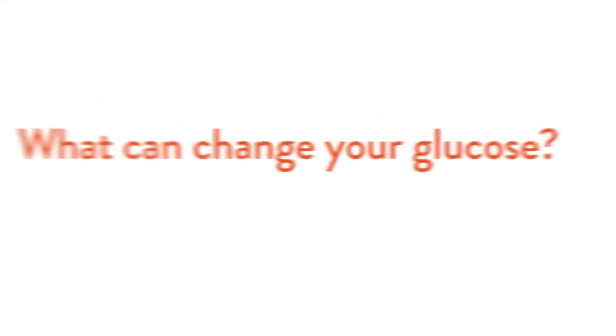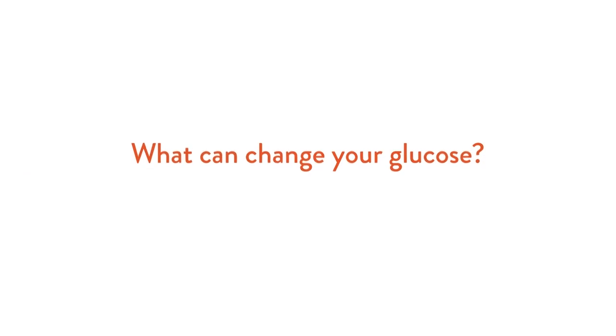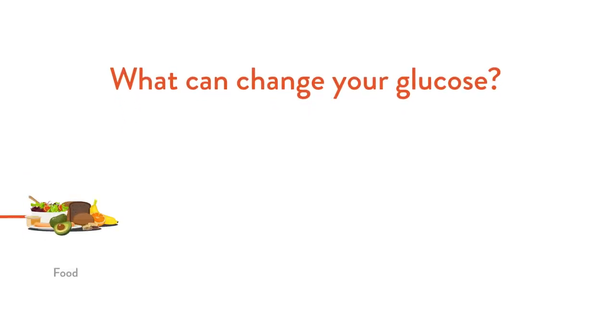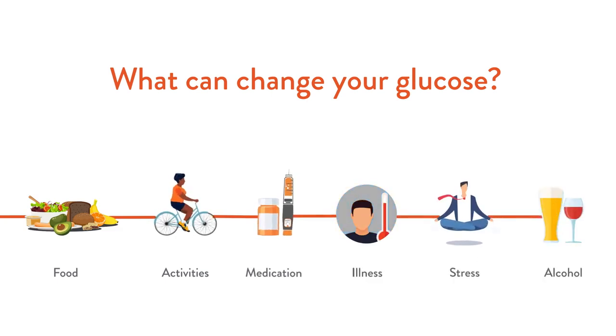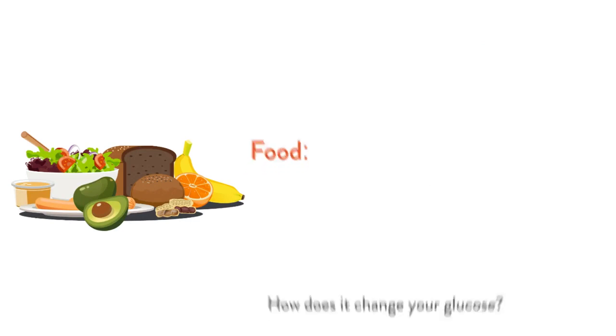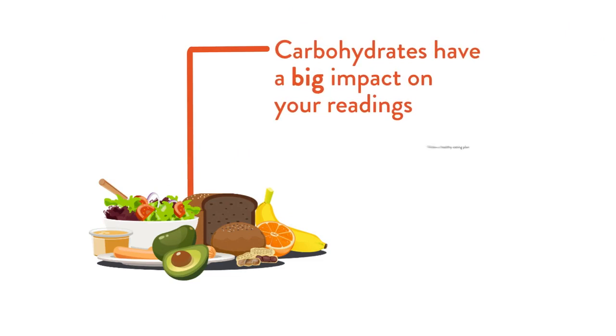What could have changed your glucose in the middle of the night? It is important to consider the effects of food, activities, medication, illness, stress, and alcohol on your readings. Part of your self-management is following a healthy eating plan and paying attention to carbohydrates.